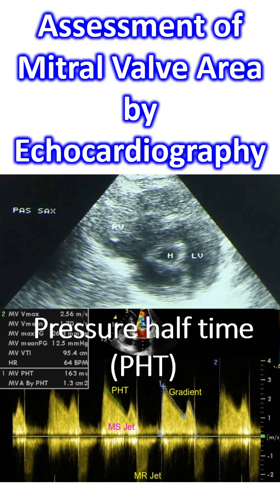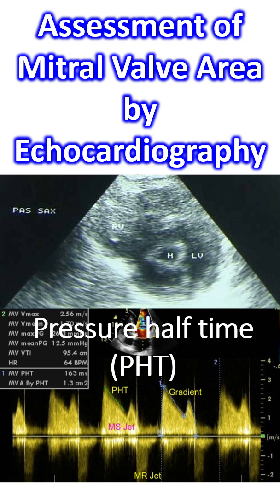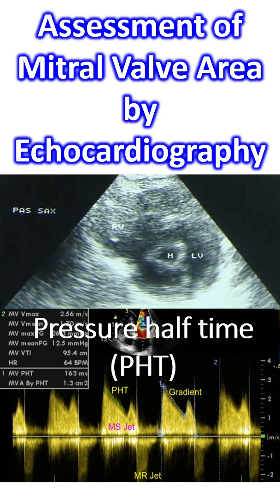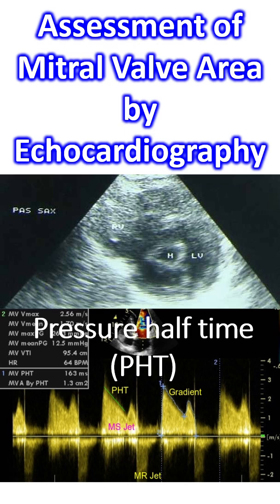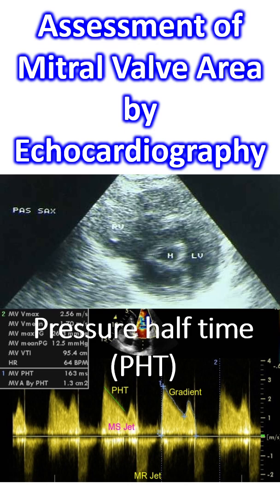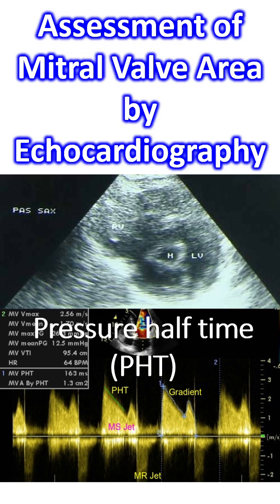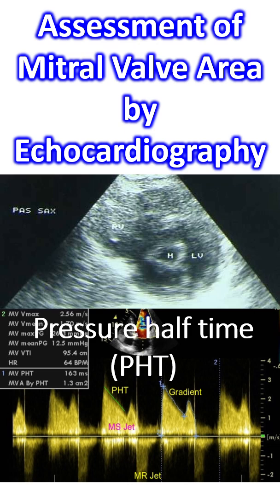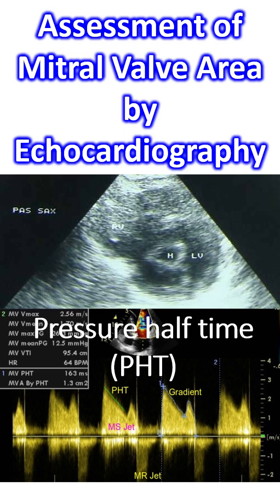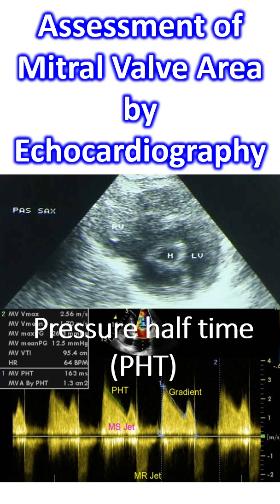Measurement of mitral valve area after balloon mitral valvotomy follows the same pattern. Measurement using real-time 3D echocardiography is superior to 2D planimetry of mitral valve area in the immediate post-valvotomy period. Real-time 3D echocardiography valve area has the best correlation with invasively determined mitral valve area in this setting.